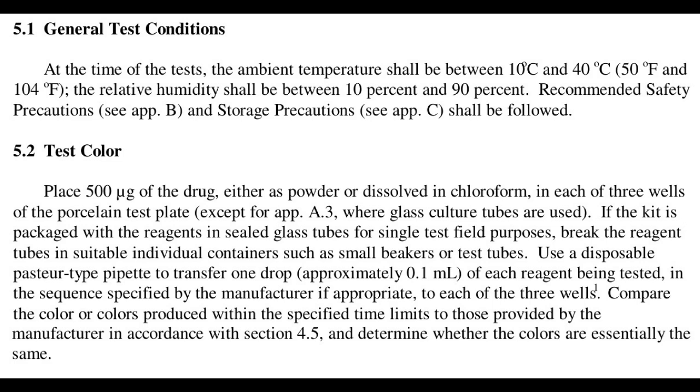But remember, this document was written for law enforcement people, and presumably all of this stuff is meant to hold up under some lawyer tearing it apart in court. Anyways, using a disposable Pasteur-type pipette, transfer 1 drop, that's approximately 1/10 of a milliliter, of each reagent being tested in the sequence specified by the manufacturer if appropriate to each of the 3 wells.